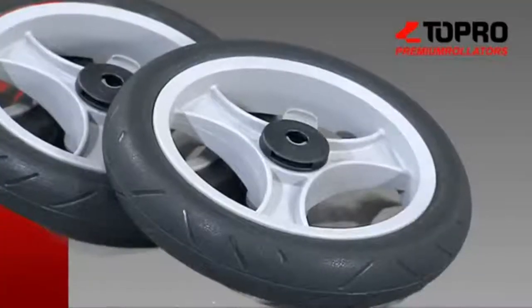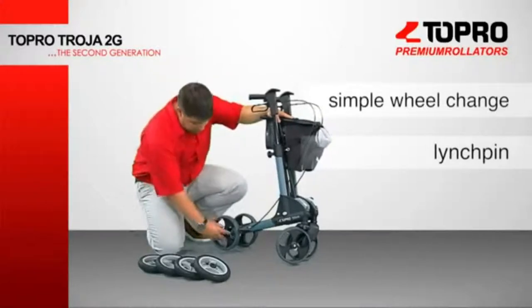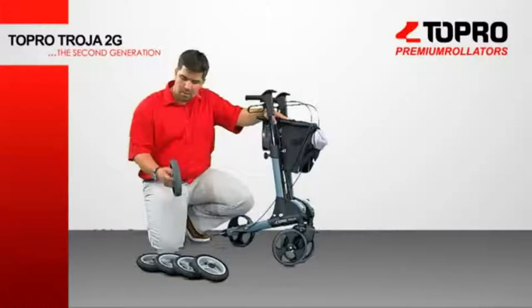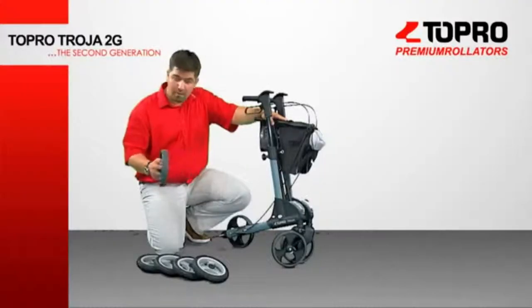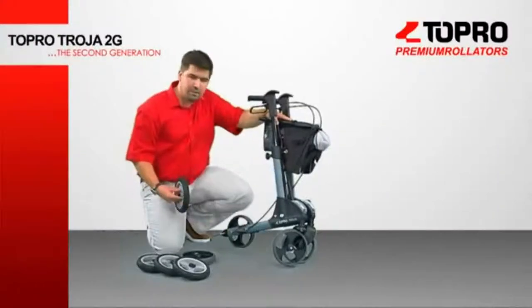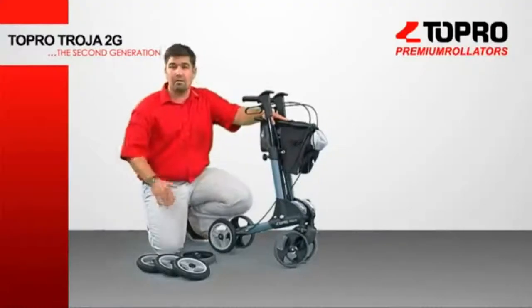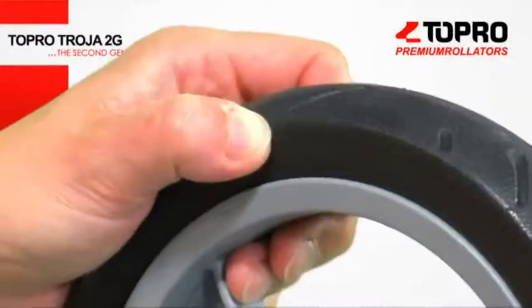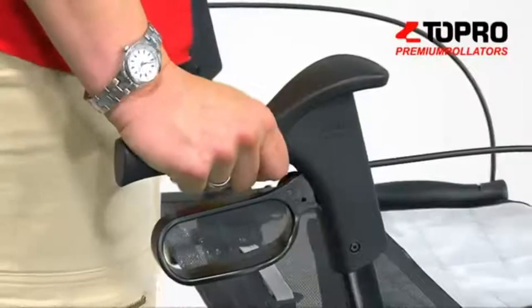The Troja 2G is the first premium rollator on the market with the ability for a simple and quick wheel change. The basic 2G model comes equipped with our well-known comfort wheel grip for flat and smooth surfaces. For bumpy and uneven surfaces, we now offer the comfort wheel soft. The soft wheels are really easy to mount and act like a suspension for your hands, wrists, and shoulders.